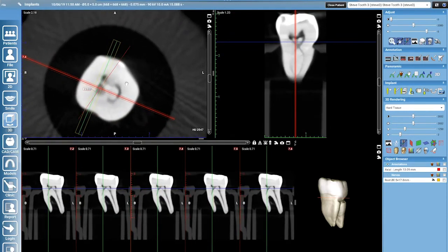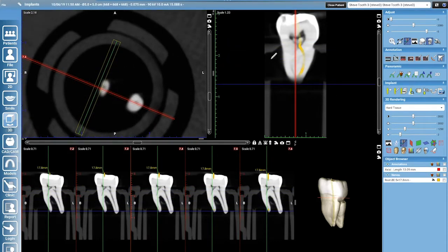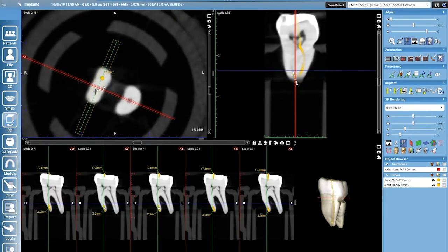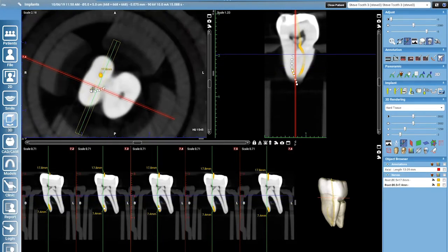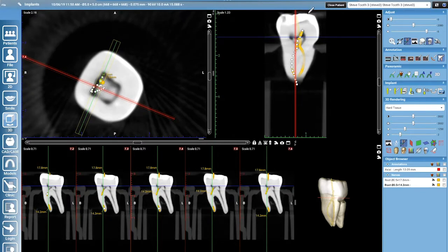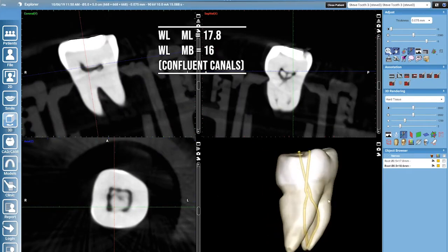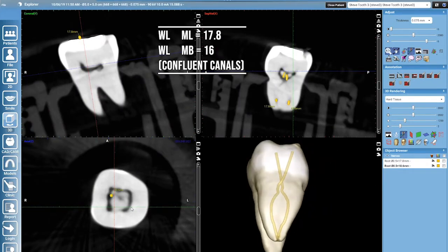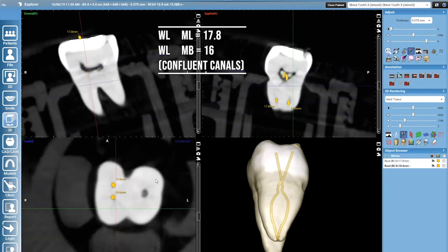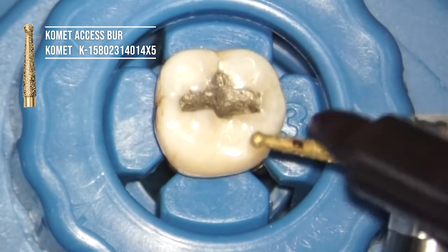So I'm just going to start mapping from 1 millimeter back and just following the root canal system along, which is going to give us a really good outline form up to the buccal cusp there, and there's our working length on the mesiolingual and mesiobuccal. And then the full tooth view, you can see the outline of the root canal system proper, which really is satisfying because you know what you're up against. And these curves are not insignificant. So that's a 4 millimeter mark there.